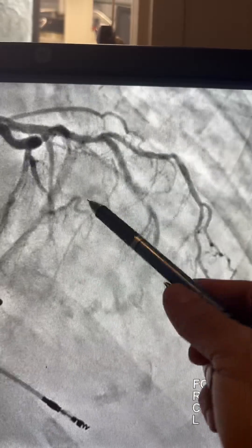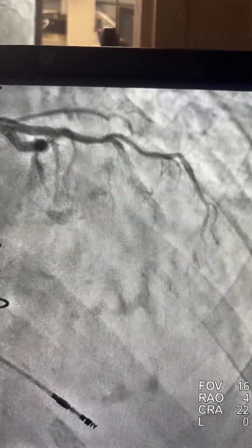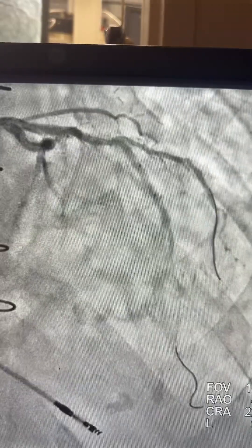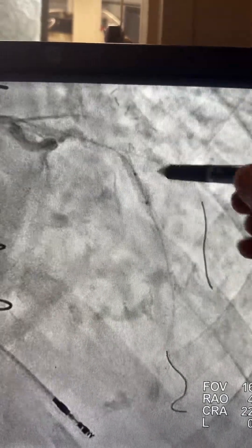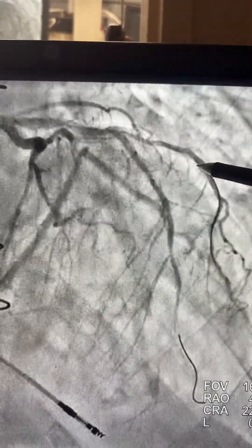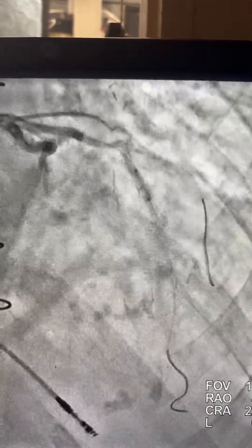We have shadowing of the circumflex graft, so we're going to work on the LAD and diagonal first with two wires. I'm going to clean the stent of the LAD, and after cleaning the stent, we're going to place a stent toward the diagonal, which is an unprotected vessel.